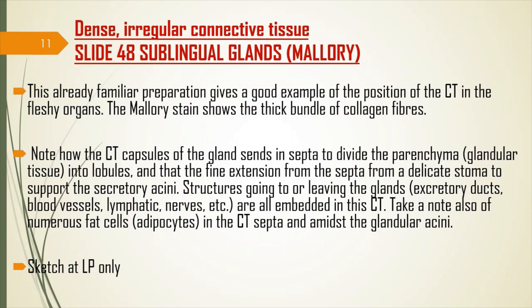All right. Let's move on to dense irregular connective tissue that is demonstrated in sublingual glands. We've seen sublingual glands before when we were doing exocrine glands. In this diagram, you should only draw it at low power. What happens here is that the connective tissue is made up of collagen fibers, and the connective tissue will separate the sublingual glands into lobules.